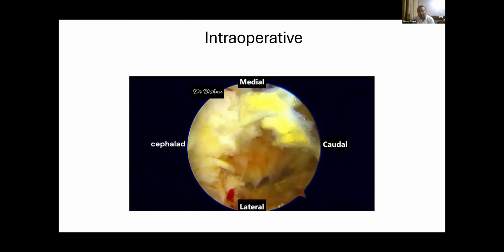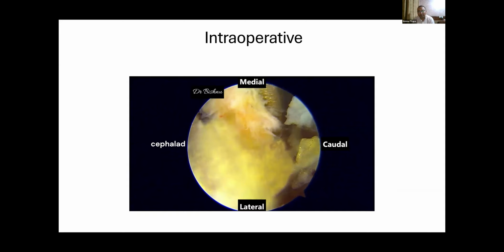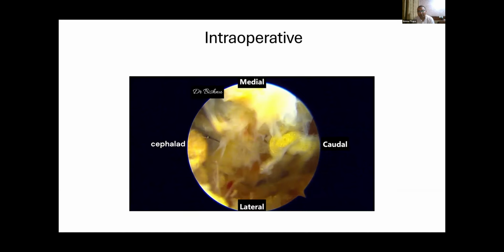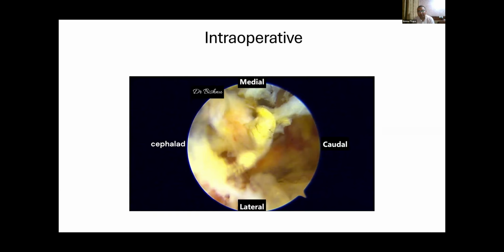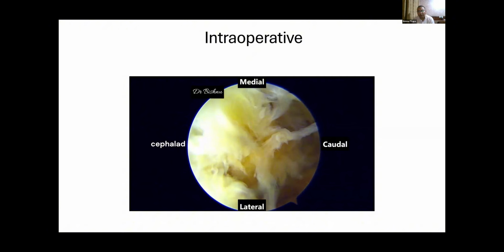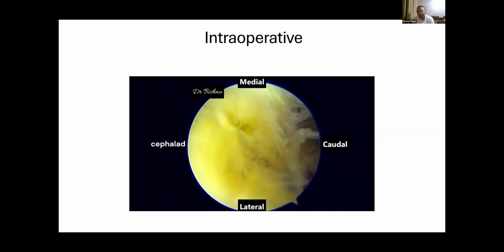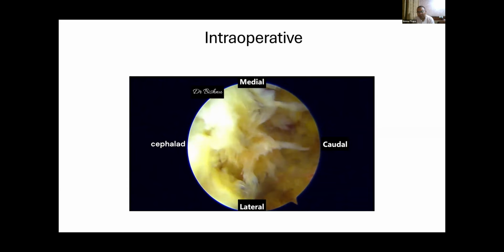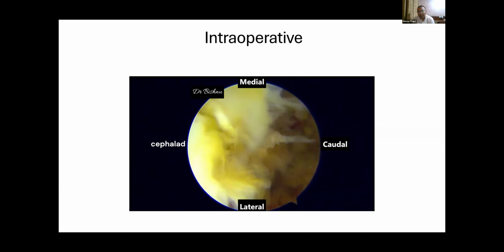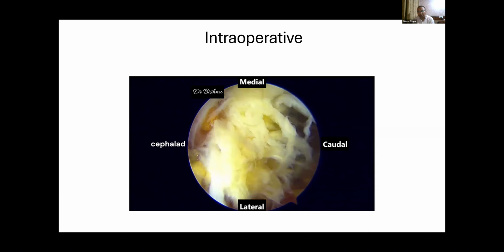I'm sorry that the video is slow. Okay. So I usually use the 3 mm burr, and for RF, before exposing the neural structures, the coagulation is 3 and cautery is 7. Once the neural structure is exposed, the cautery is 5 and coagulation is 1. So the large fragment is coming out.